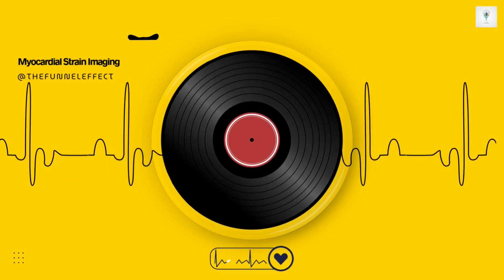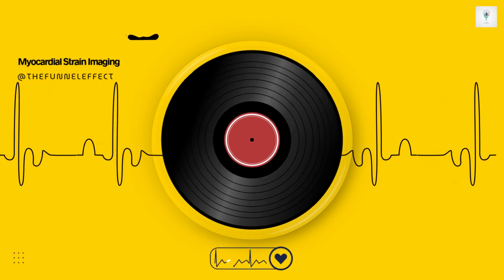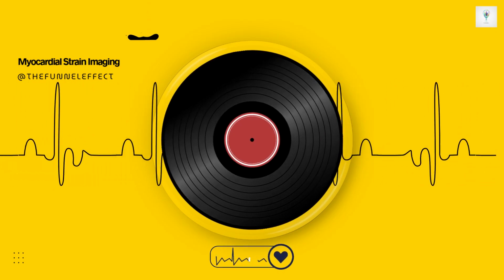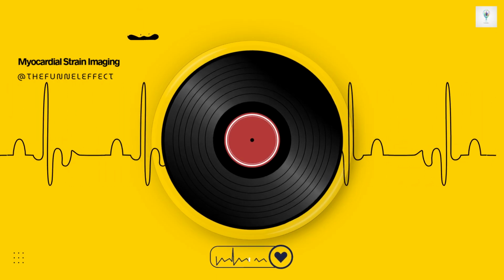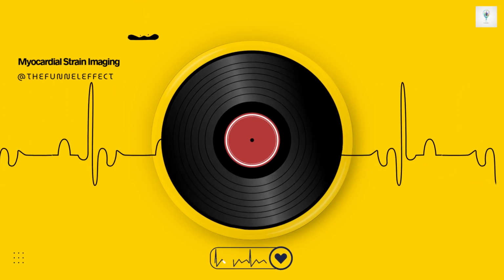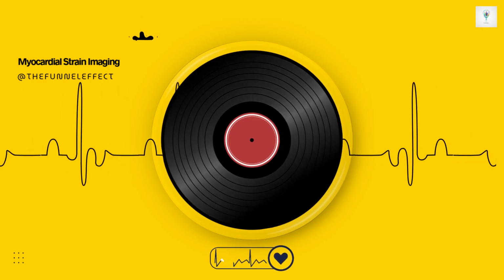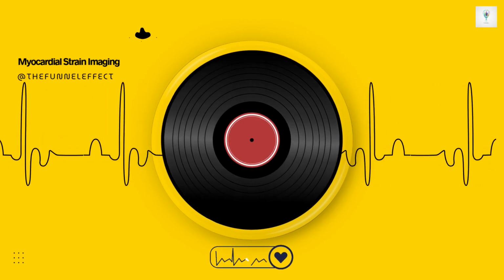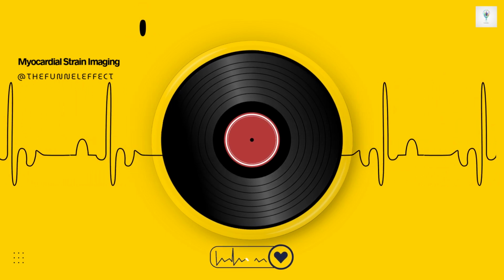The area enclosed by that loop represents the external myocardial work performed, usually expressed in units of millimeters of mercury times percent, mmHg%. So it's translating a fundamental physiological concept, pressure-volume loops representing work, into a clinically measurable index using strain instead of volume. Exactly. It brings that energy concept right into the clinic using readily available data.